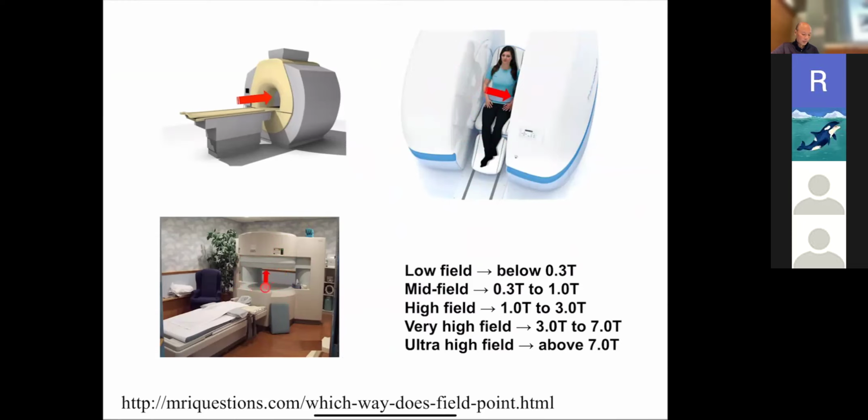They're very useful. For example, you can imagine if you just had to have your hand scanned or your leg scanned and you're claustrophobic, this would be a much more friendly environment. This has the advantage that if you wanted to look at someone's back, so experiments where you're looking at back pain and stuff, you can have them stand up or do flexion and things like that. All right. They tend to be lower field because it's just harder to get strong fields. The other application of these types of magnets is if you wanted to do MRI in the operating room. Okay, so then you have more access.